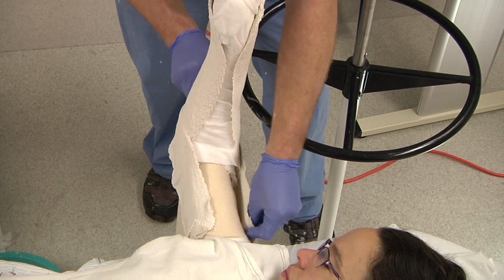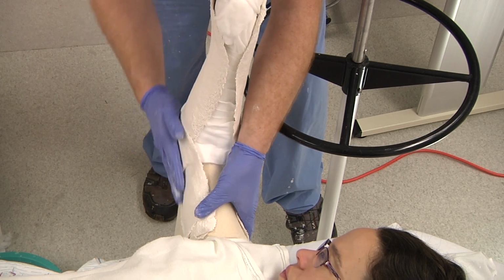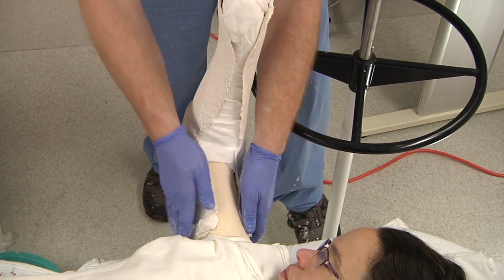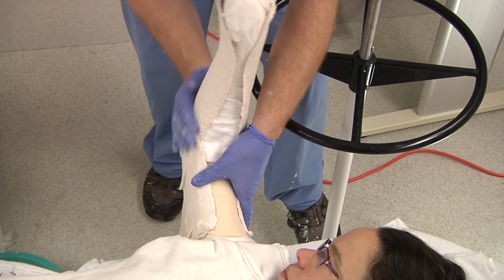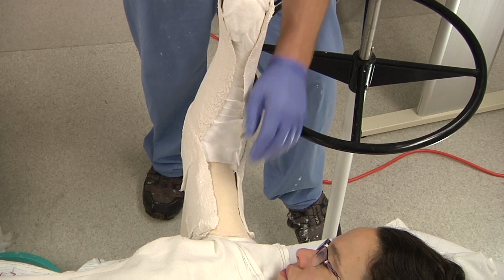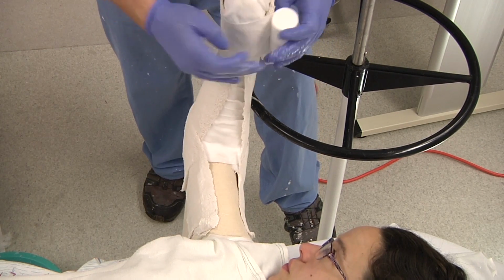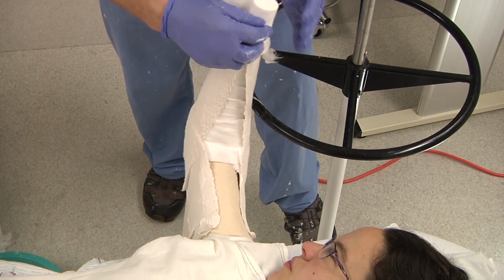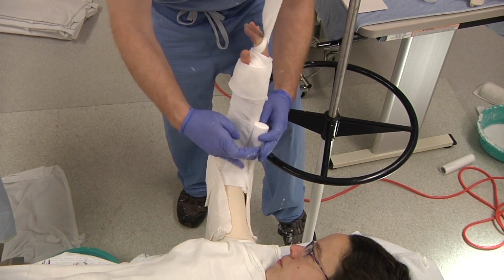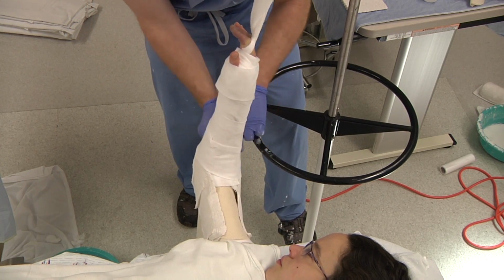Next. Here, this is what's taking away rotation of the forearm, making sure we're good at the tops and at the bottoms here. So wherever you have intersections of plaster, laminate them together. Cover everything up so that we're helping out our cast techs or whoever has to take this off later.